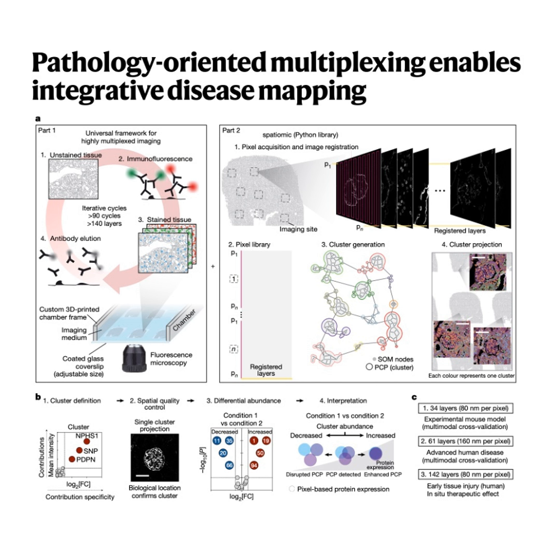Fundamentally, PathoPlex feels like a shift in perspective. We're moving beyond just classifying cells based on their general appearance or a few markers towards a really data-rich approach that captures these distinctive biological signatures across different spatial scales, from the whole tissue down to inside organelles. It really does pave the way for what you might call next-generation pathology atlases. And the accessibility aspects, like working with standard microscopes and the 3D printer automation, help democratize this powerful approach.